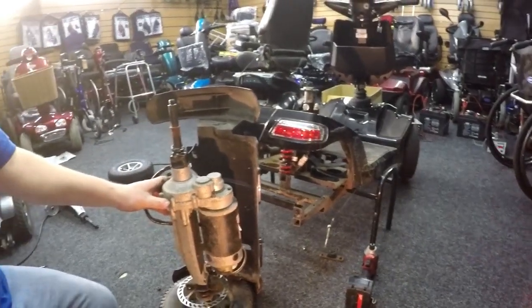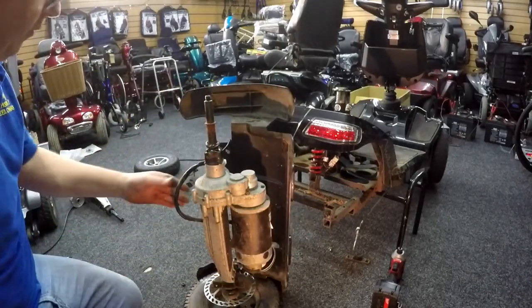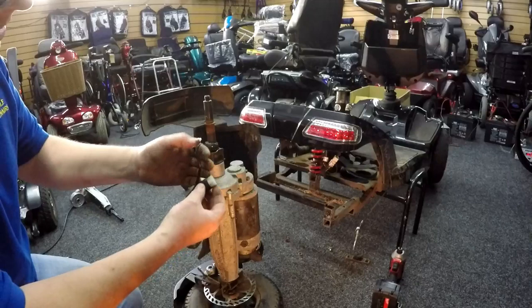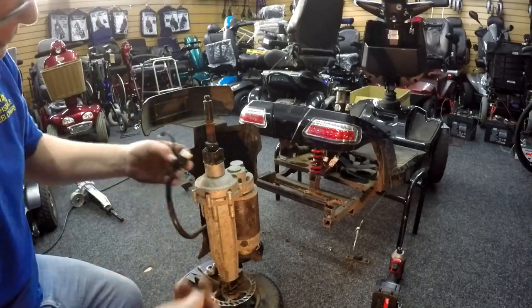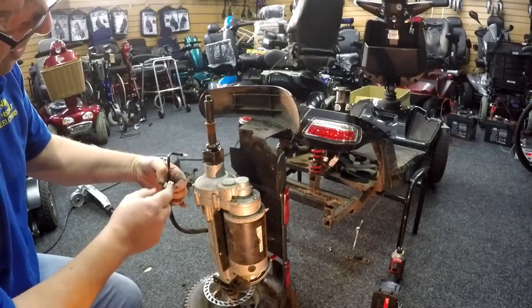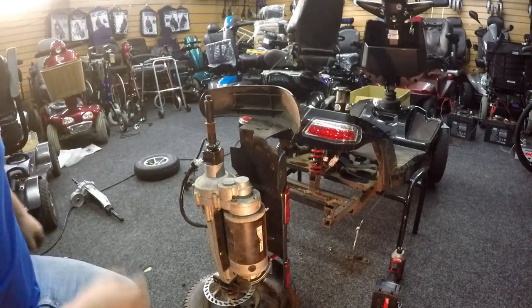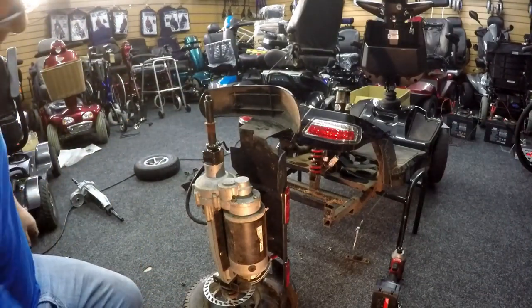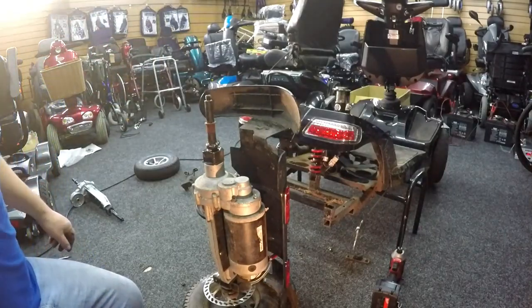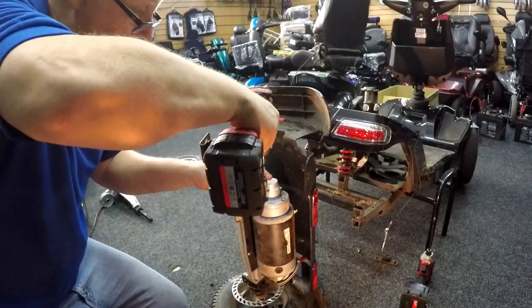One broken transaxle, as you can see. So we're going to take the motor off. That's the motor loom here. That's the one for the electric brake, and that's for the motor. So you've got 2 positive, 2 negative. It's got 4 brush units in here. So we'll dismantle that, and then we'll take that away to the workbench to see if we can get this wheel off. I'm just going to undo the 2 outside motor screws.